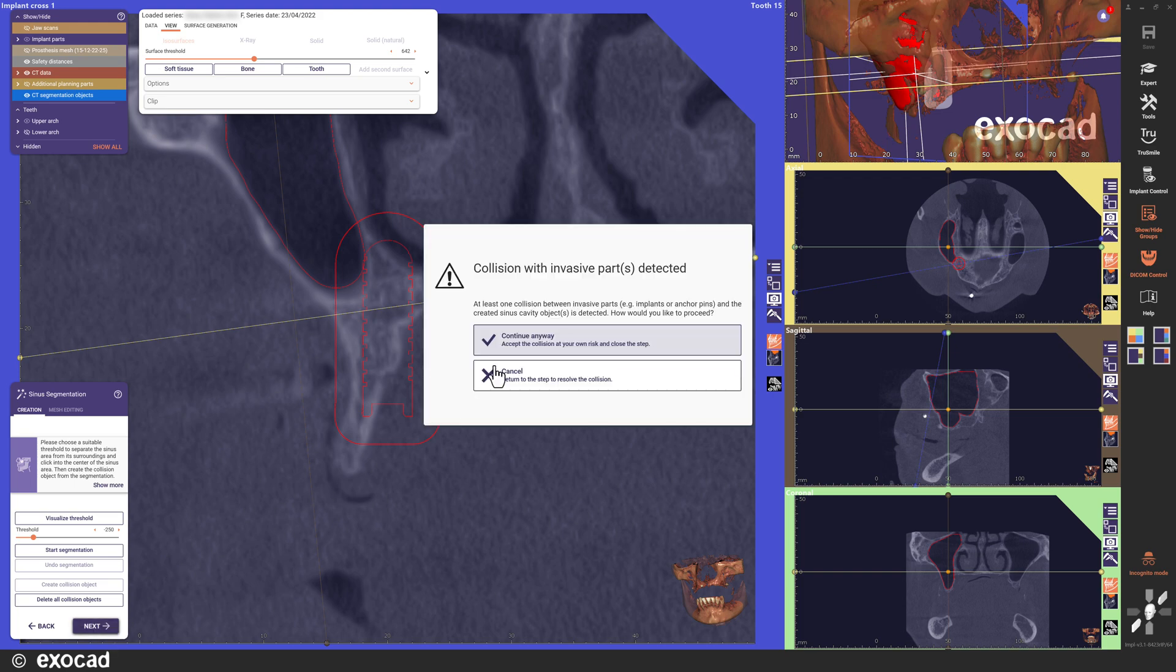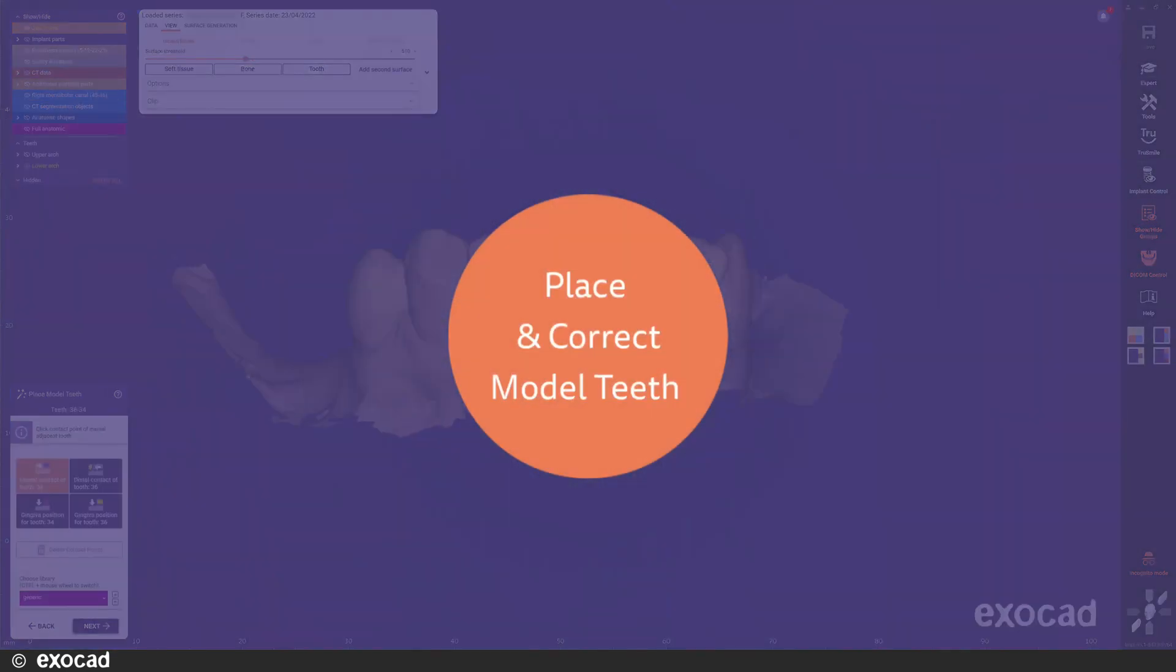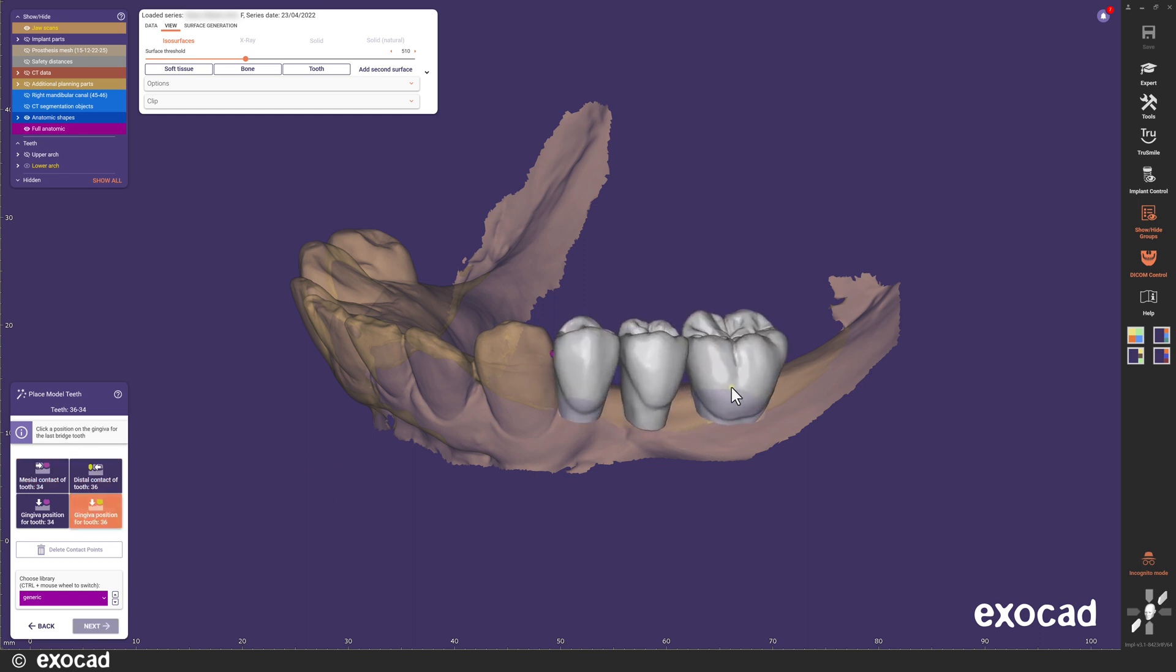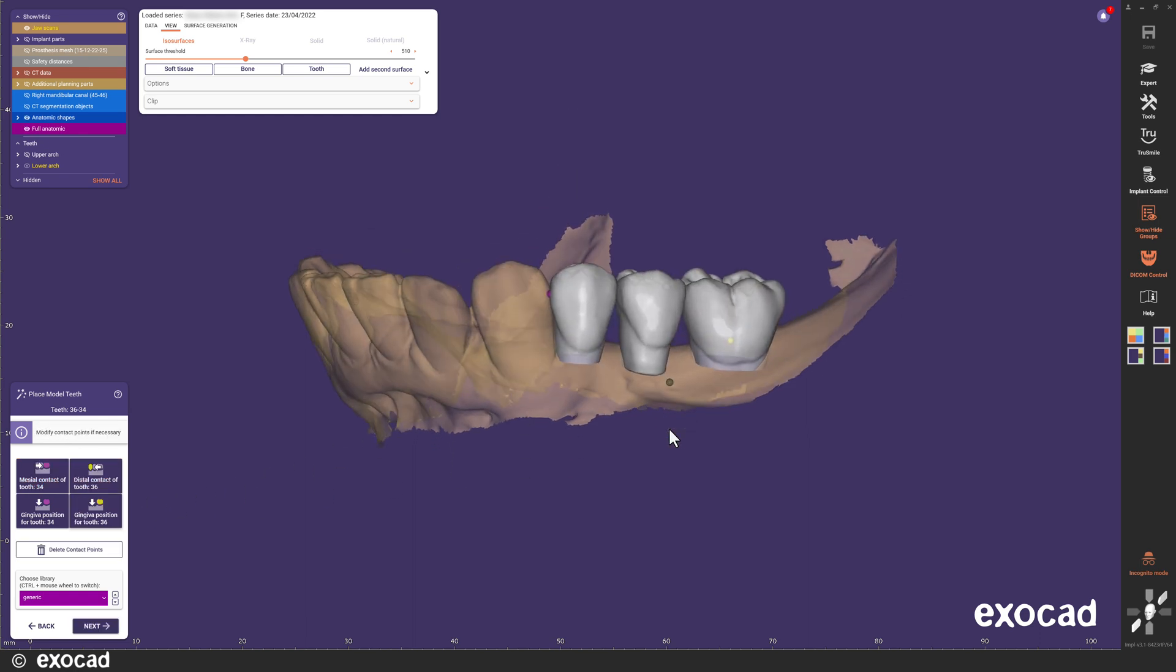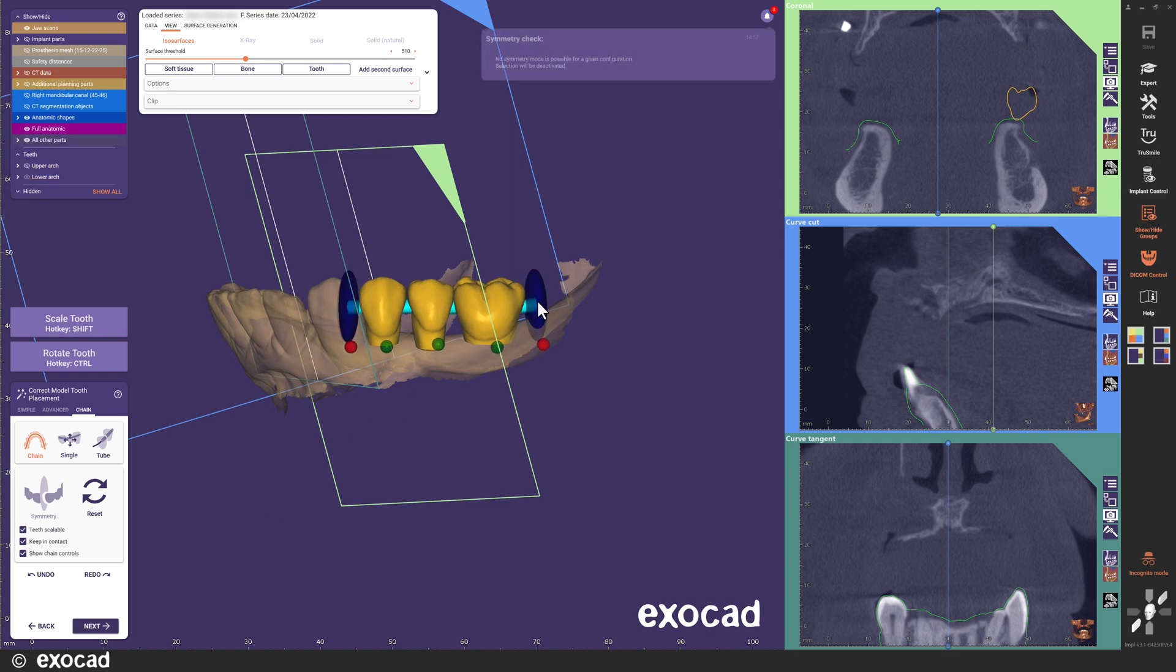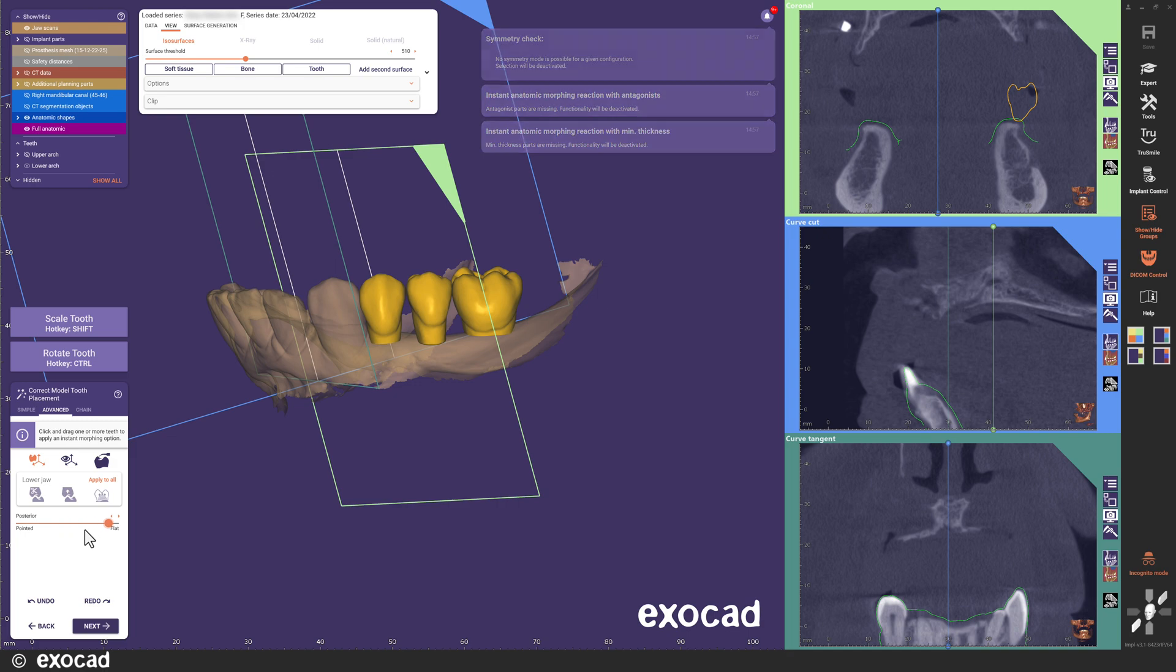In the next steps, I'll add the model teeth. Of course, I can skip the model teeth if I'd like. In the correct tooth placement step, we have a new tab, Advanced, with some improved options to modify the tooth models.